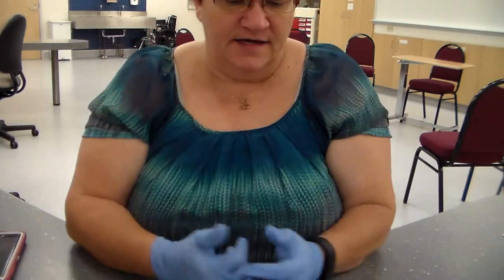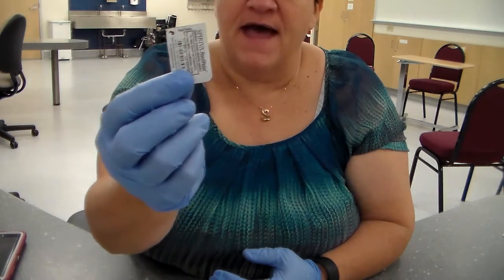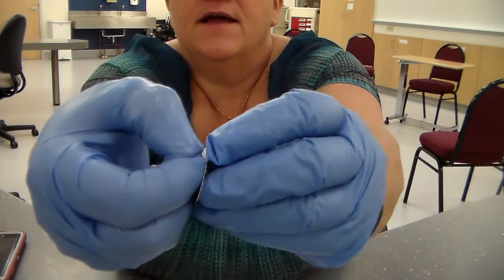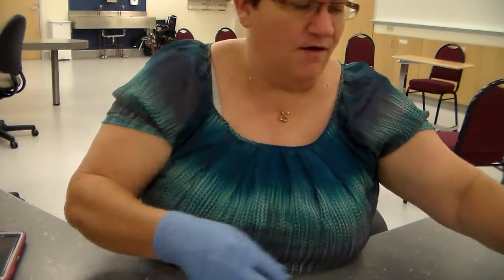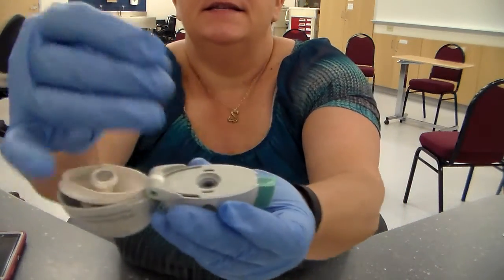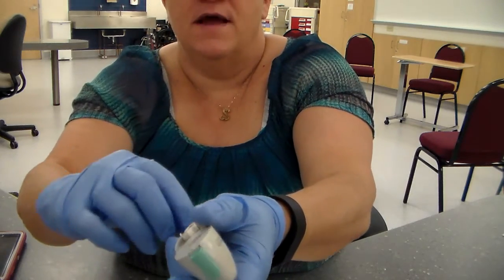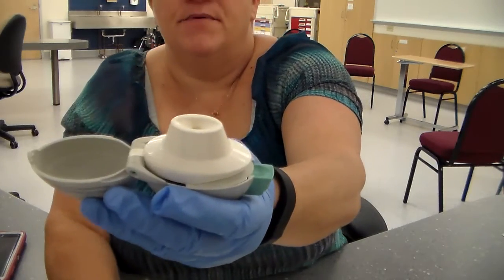So you're going to assist that client to a comfortable sitting position. You're going to remove the capsule from the package, and the packaging looks just like this. You just open it up here, on the side. You see how you can just pull that apart? So you take the capsule out, and you put it inside of that hole. It only can go in lengthwise. And then you're going to close this white part over until you hear it snap.